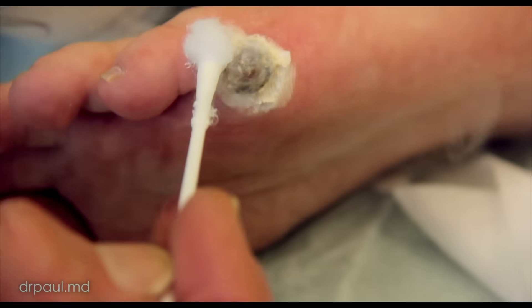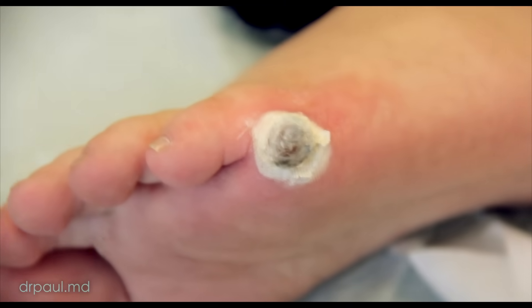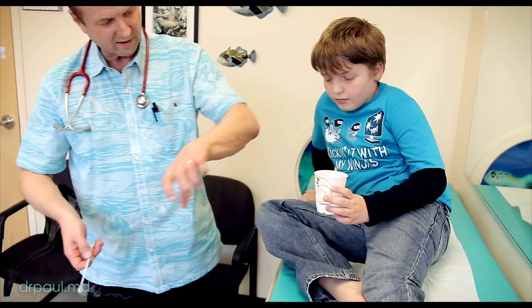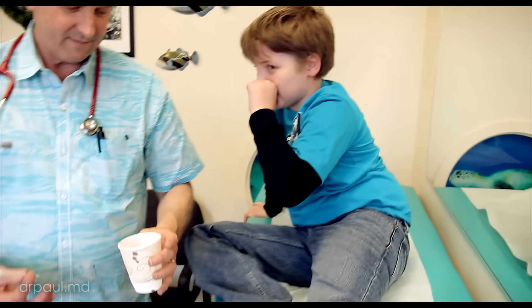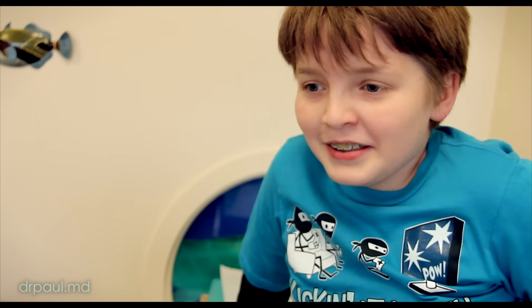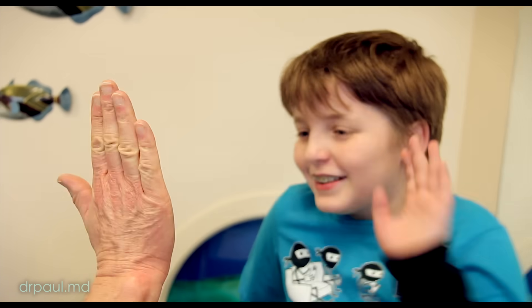Okay, I think you're good. So before it all evaporates, you get to drop this on the floor — just pour it on the floor, it's kind of fun. That's cool! So that's a shockwave and explosion — that's the only reward you get for letting me torture you. Give me five. That was awesome, you did a great job.